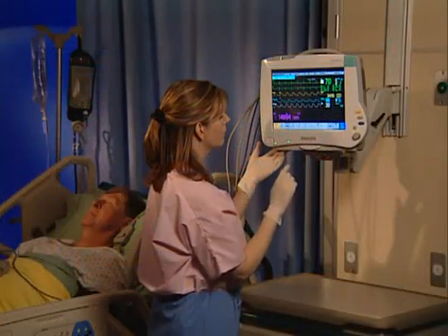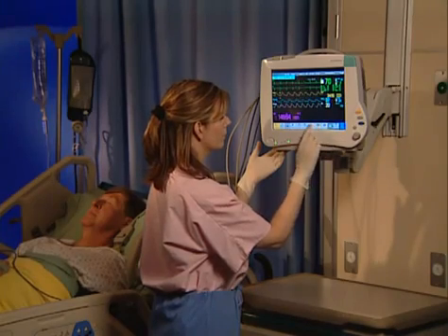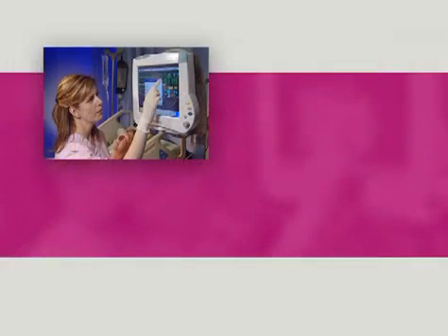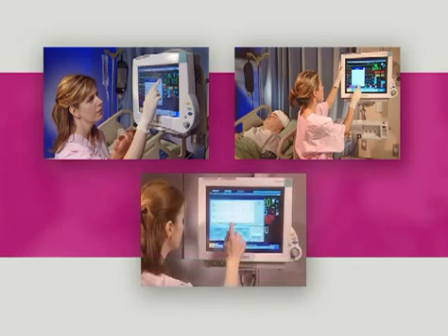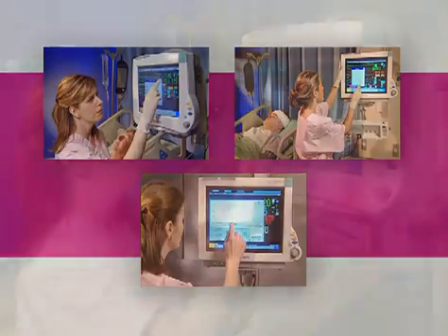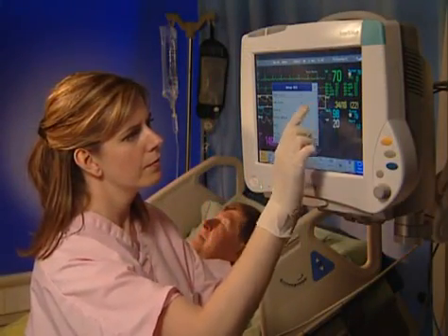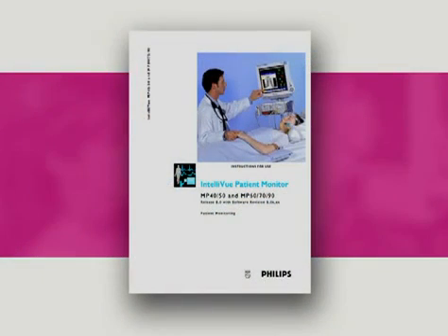For the purposes of this program, we'll demonstrate operation using the MP50 with a standard configuration. You can assume that unless specified, an operation is performed the same on other members of the IntelliView patient monitor family, except for the navigation method you would use to perform it. For additional information and the impact configuration might have on operation, please refer to the documentation included with your monitor.